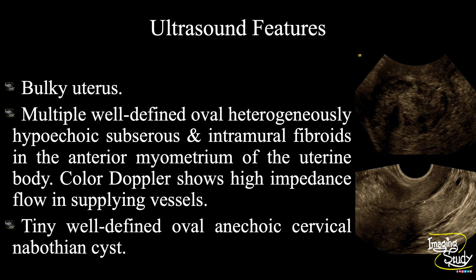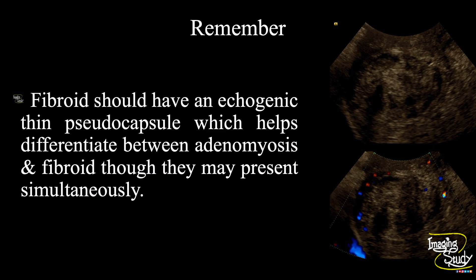In summary, a bulky uterus is noted. There are multiple well-defined oval heterogeneously hypoechoic subserous and intramural fibroids within the anteromyometrium of the uterine body. Color Doppler shows high impedance flow in supplying vessels, indicating multiple subserous and intramural degenerative fibroids. A tiny well-defined oval anechoic cervical Nabothian cyst is also noted. A key take-home message: fibroids should have an echogenic thin pseudo capsule, which helps differentiate between adenomyosis and fibroid, though they may present simultaneously.